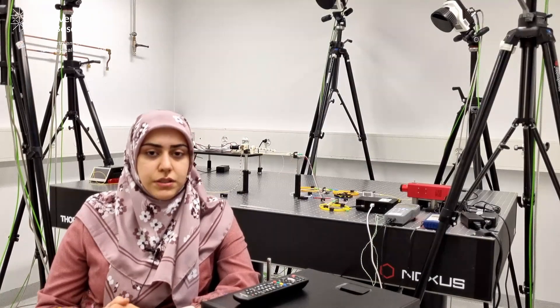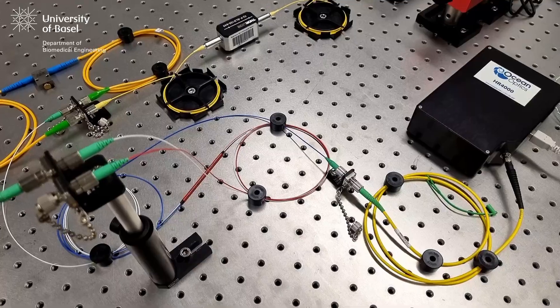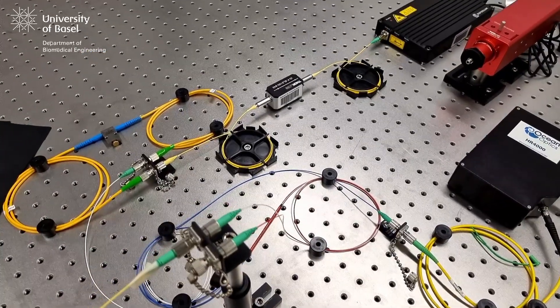Unlike conventional FBG sensors, the amplitude changes at the Bragg wavelengths are actually carrying the strain information. This allows us to use a low-cost interrogation system for monitoring the sensor's signal.